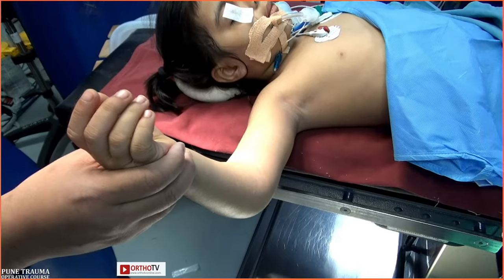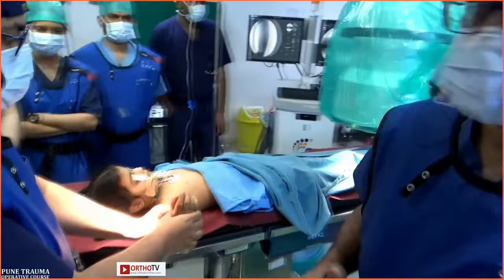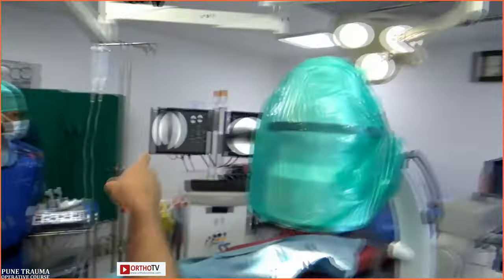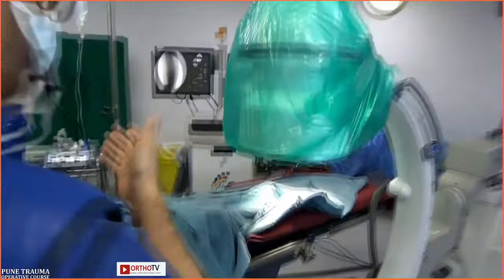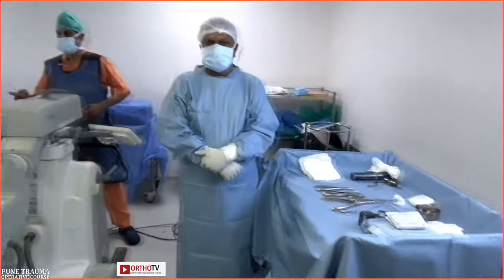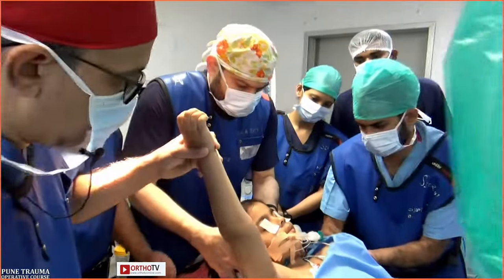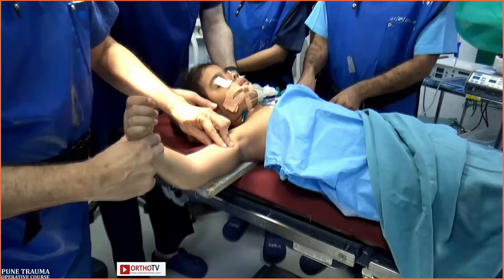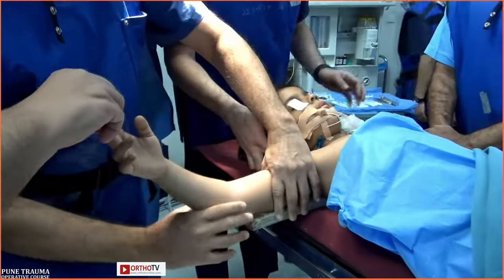So I'm just going to show you the OT setup so that everybody can follow the same in their own practice. We have the C-arm with the monitor in front of me. The table is adjustable, goes up and down, and my trolley is ready. Can I have the arm board? Now, the anesthetist here, Dr. Himanshu, is tuned to what I do. We lift the child and put the arm board on the patient's arm like this, and I bring the proximal fragment to the edge.